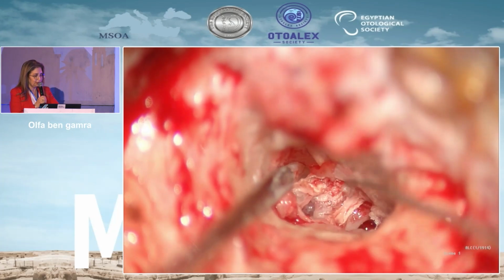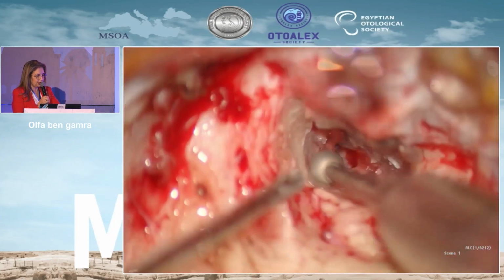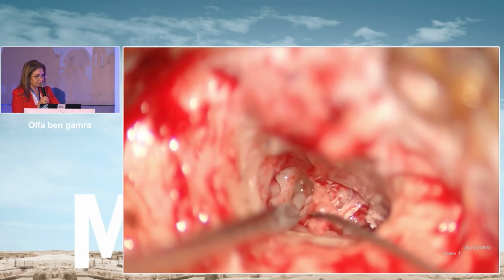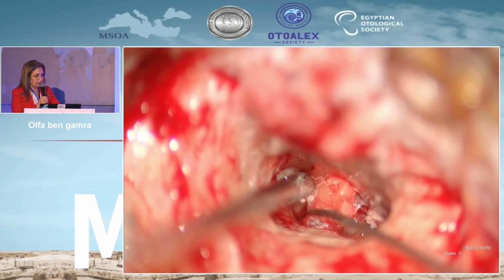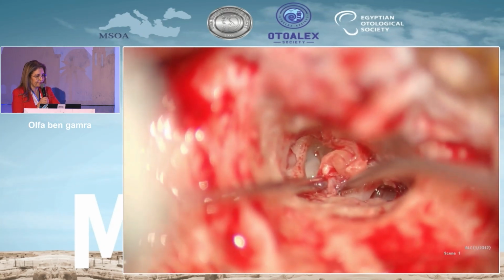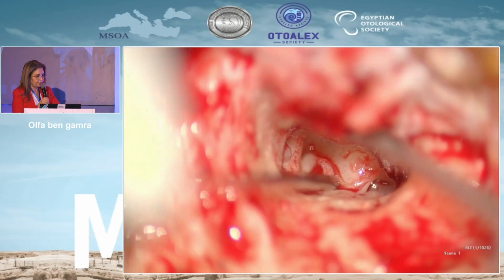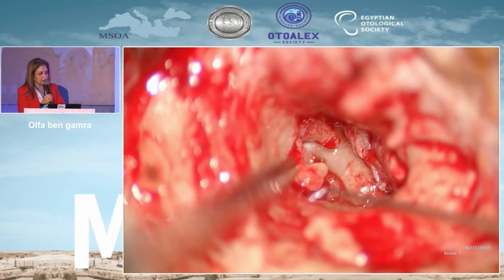Large bone defect, the incus, the stapes, and the retraction pocket is fixed on the head of the stapes. Extraction of the incus.